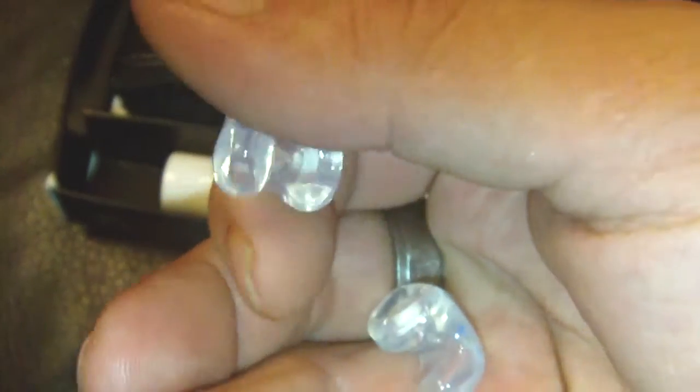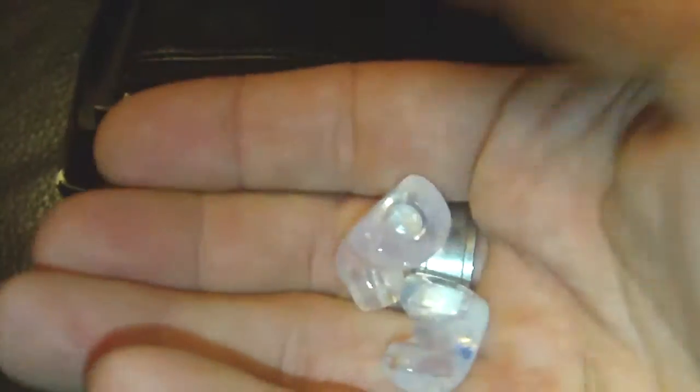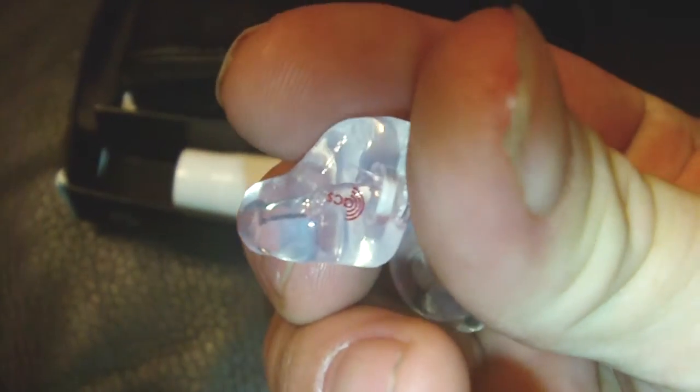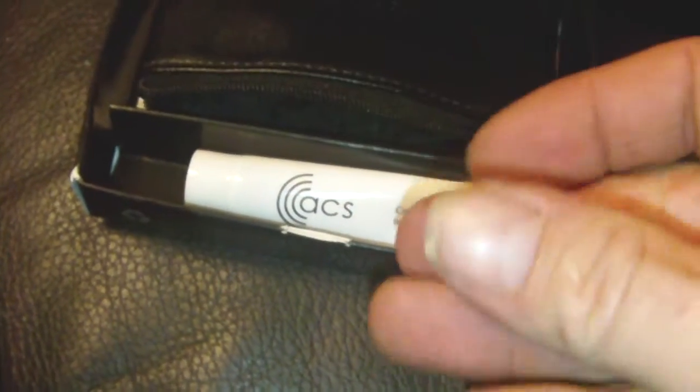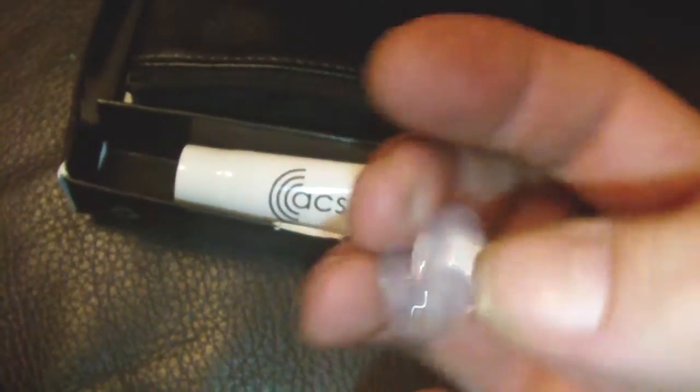Inside are two custom molded earplugs. They're actually taken from molds of the insides of my ears. One's got a little red ACS symbol on it which is the right ear — which we don't want for this one because I'll be showing you my left because it's easier — and the blue one is for your left. These are fantastic; once they go in, aim at the back of your ear so it's completely the wrong way around.